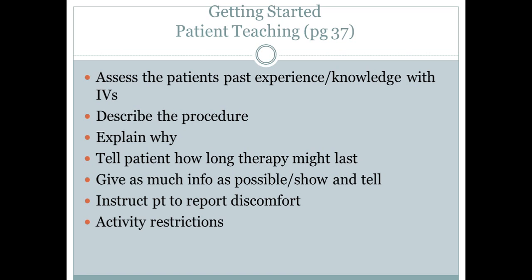So definitely let them know that once the device is secure, they'll be able to move around with little restriction, depending on where it's at. So page 37 has some great information. As well as above, they have a little formula: care plus confidence equals a relaxed, cooperative patient.